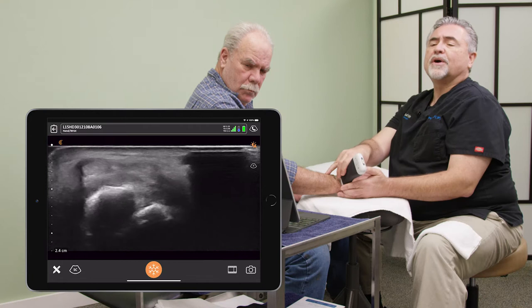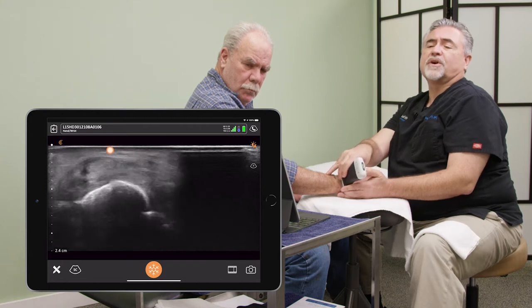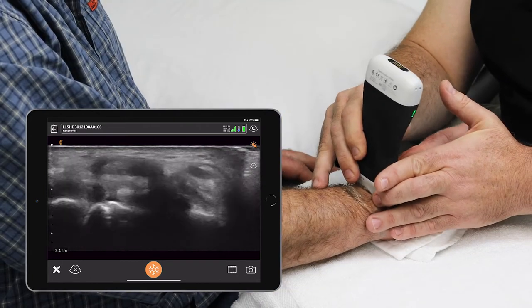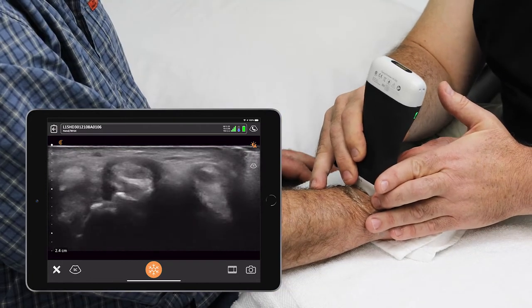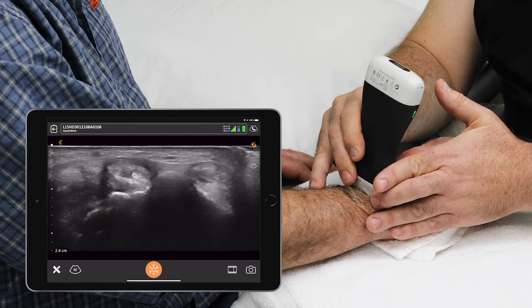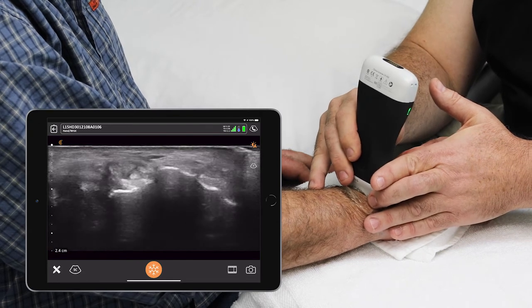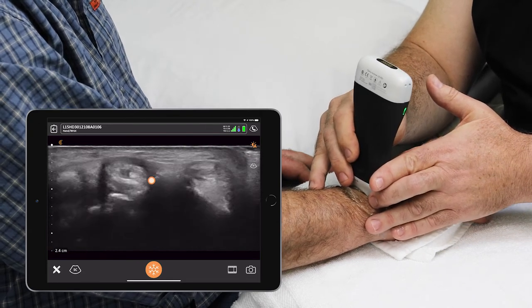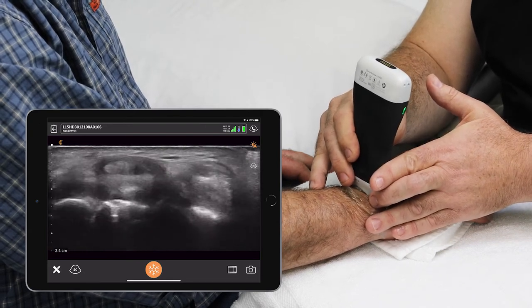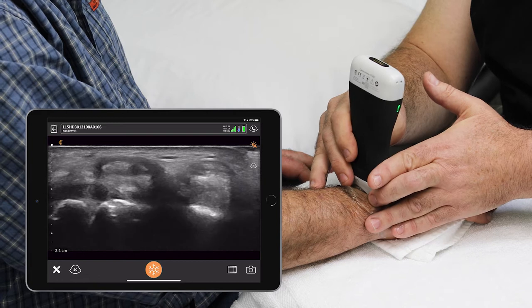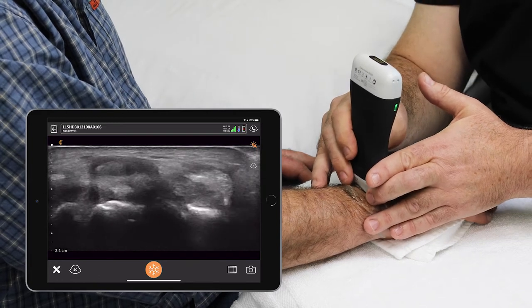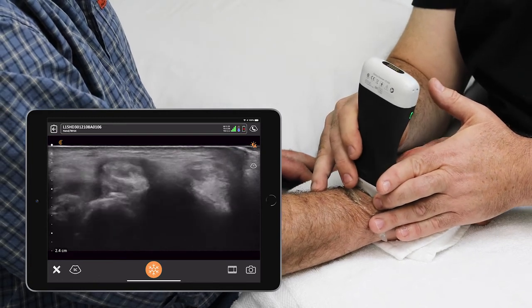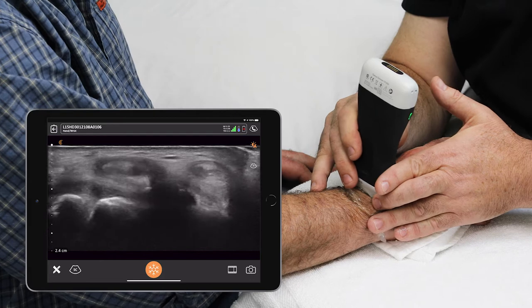Moving all the way over to the extensor carpi ulnaris, you can also see that darkened area around it — the thickening of the synovial sheath — continuing to demonstrate that he's put some miles on these wrists.